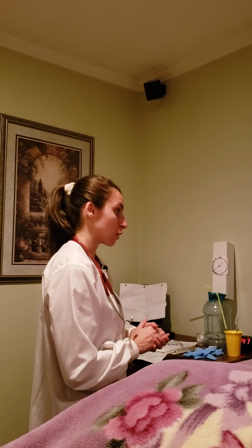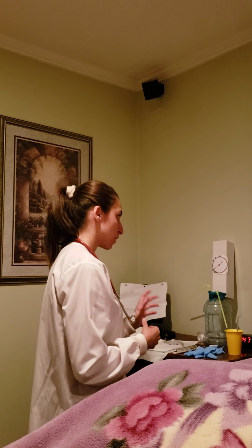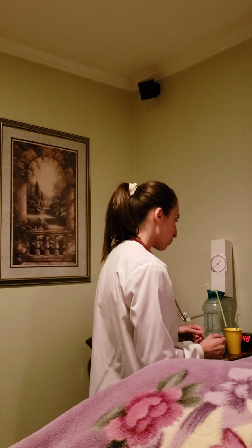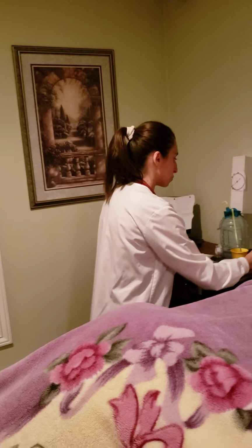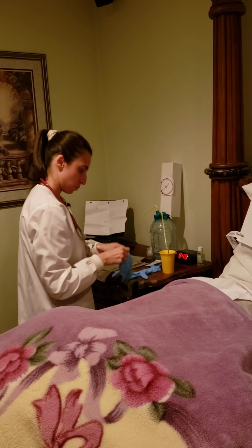No? Okay, Ms. Carmel, so I'm going to start preparing the NG tube and yourself. So what I'm going to have you do is first put some gloves on.